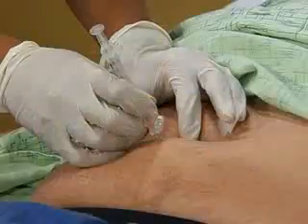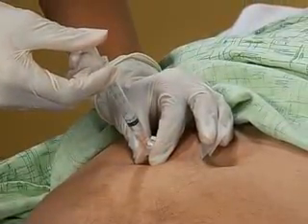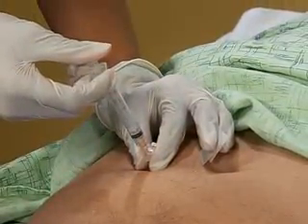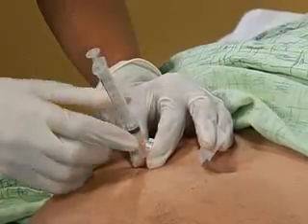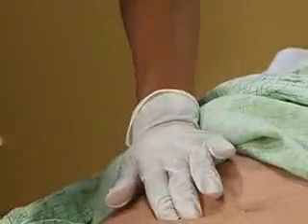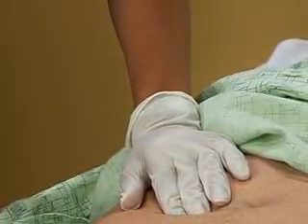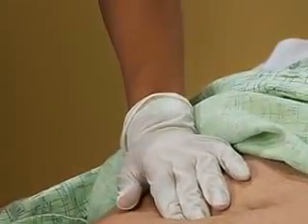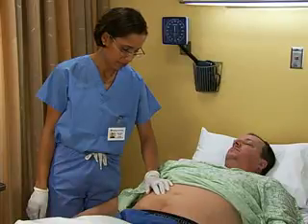Once the needle is in place, stabilize the lower end of the syringe with your non-dominant hand and slowly inject the medication with your dominant hand. Avoid moving the syringe. Then withdraw the needle while placing an alcohol swab or sterile gauze gently over the site. Engage the needle safety device and apply gentle pressure to the site, but do not massage it. If heparin was given, apply pressure for 30 to 60 seconds.